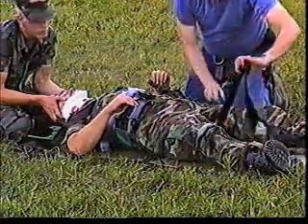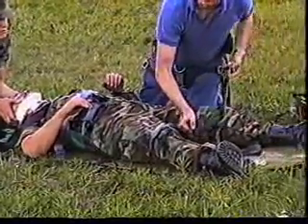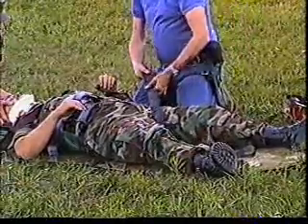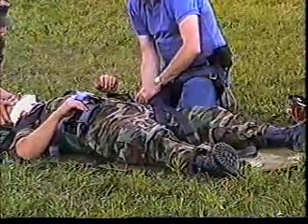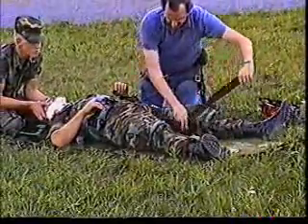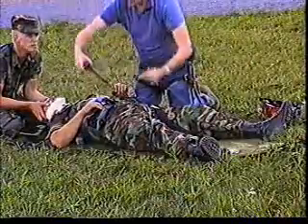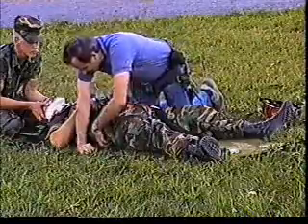Okay, now the groin straps, tug on them and make sure that they're completely straight. Bring it against the thigh so we don't destroy the family jewels. Fasten the buckle once again. Feed it in there. We make these straps excessively long because we find obese patients that use up all of the webbing that we've got on here.